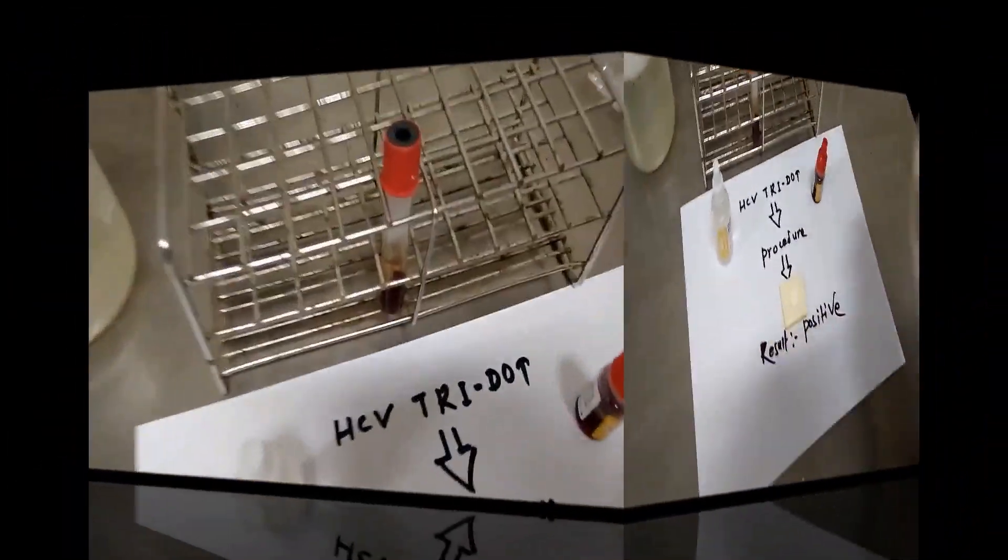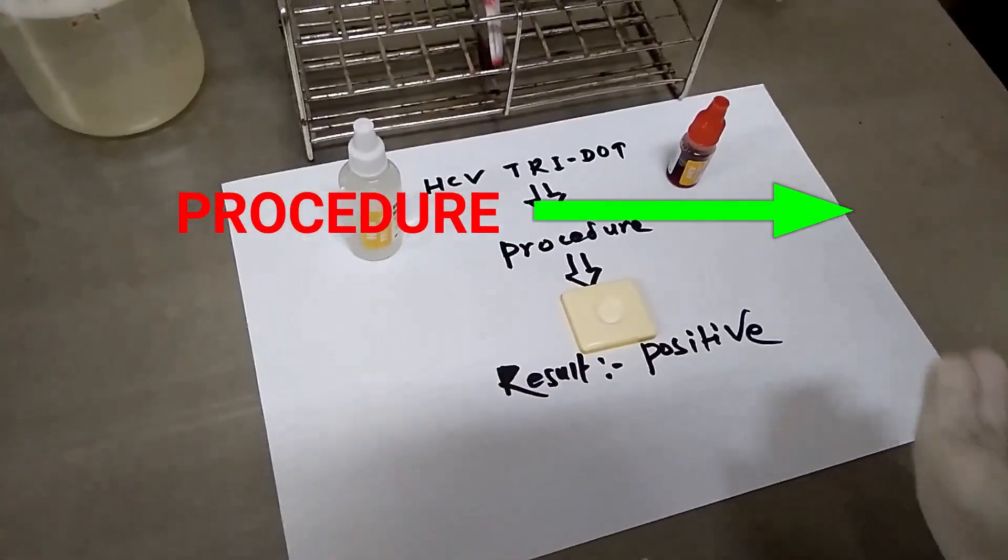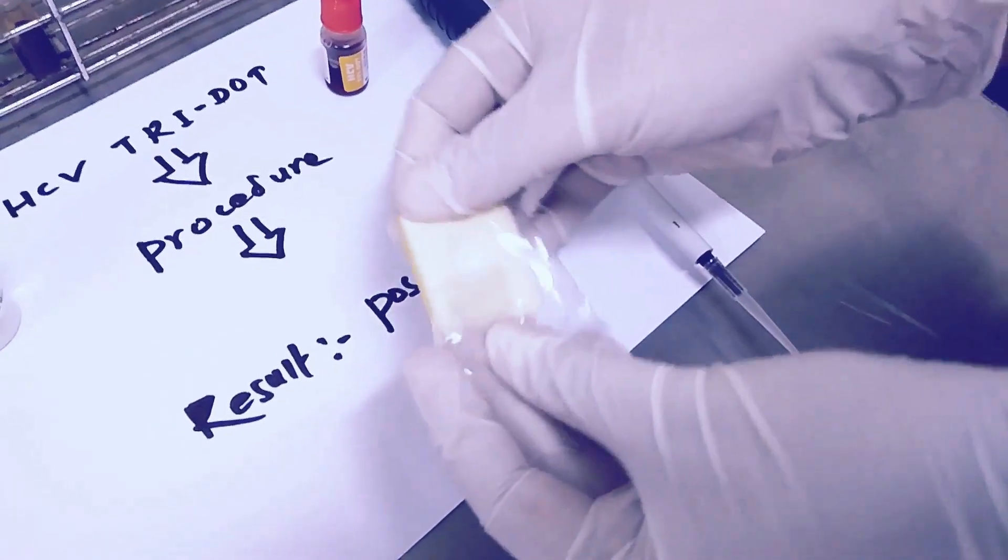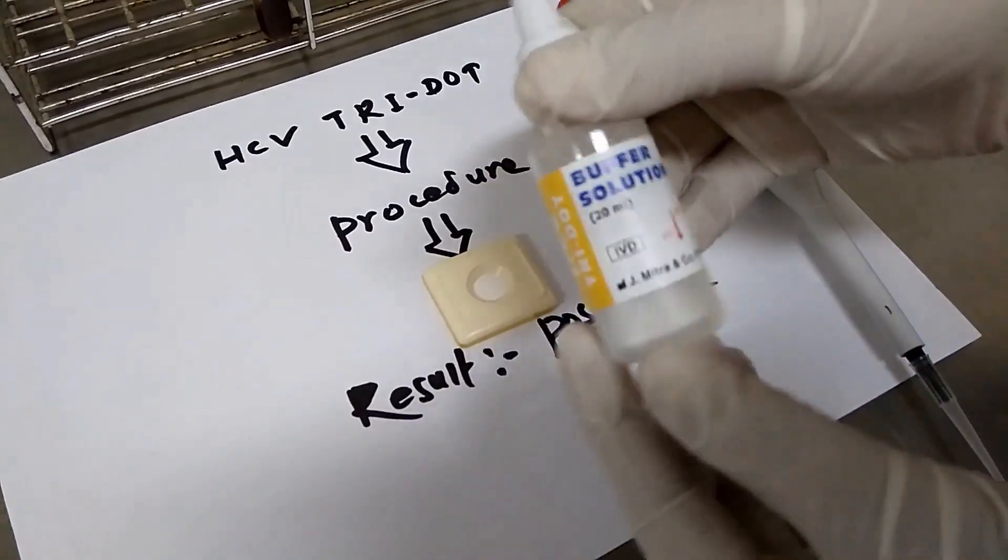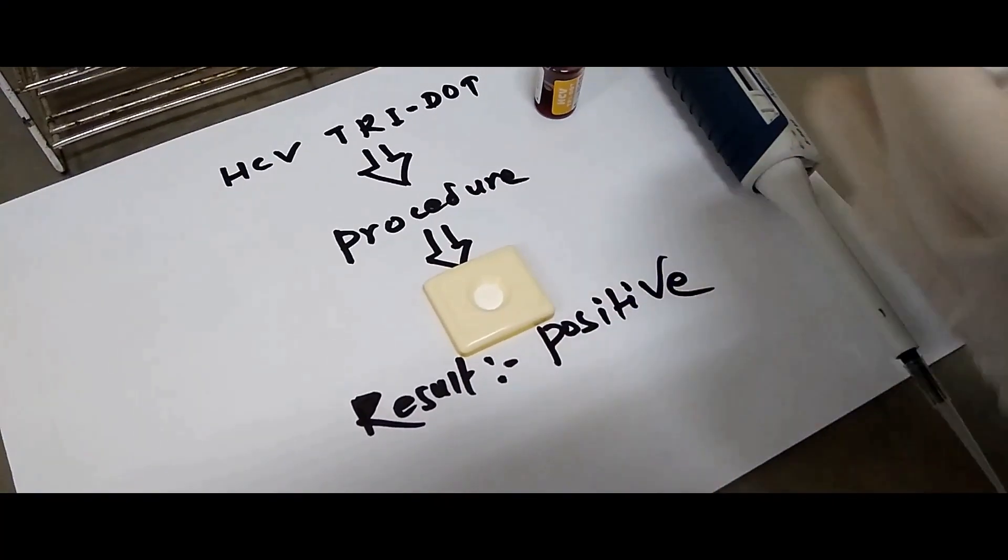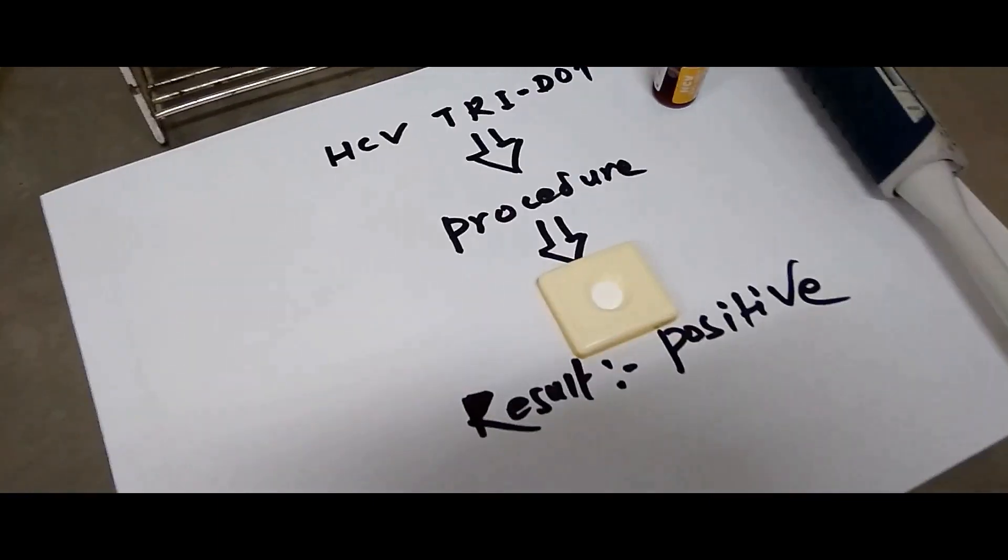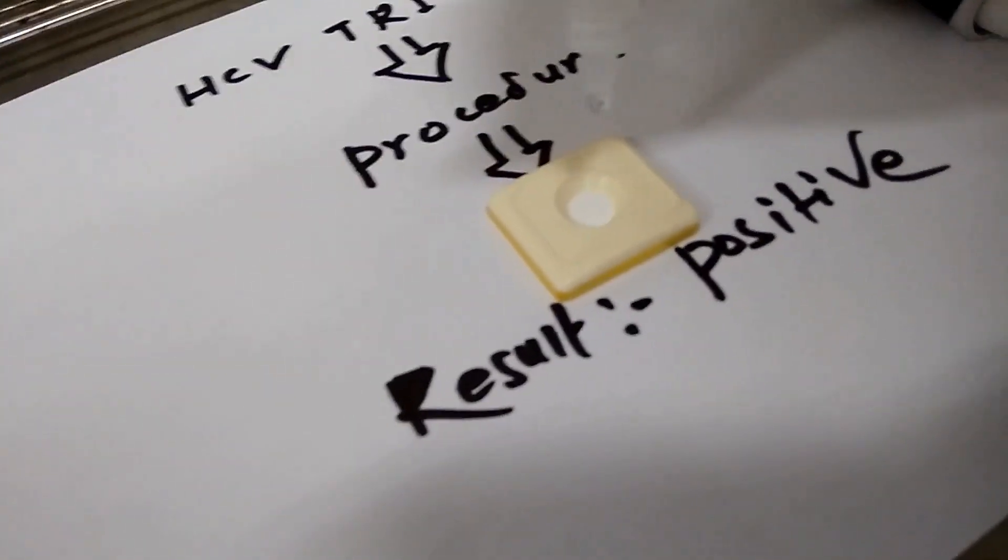Now about procedure. Open the sleeve pouch and remove the test device and use device as soon as possible. Add 3 falling drops of buffer and wait for drying.